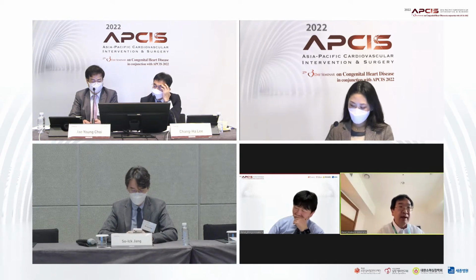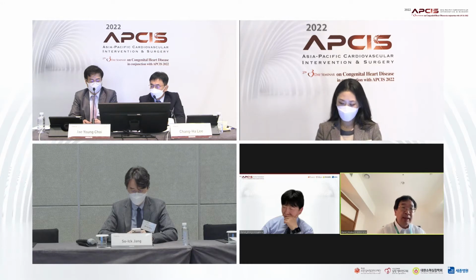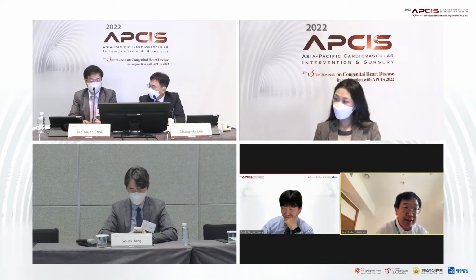So usually I remove the LPA stenting. However, we have to be careful in LPA stent removal. This stent was from the LPA junction to the hilum.